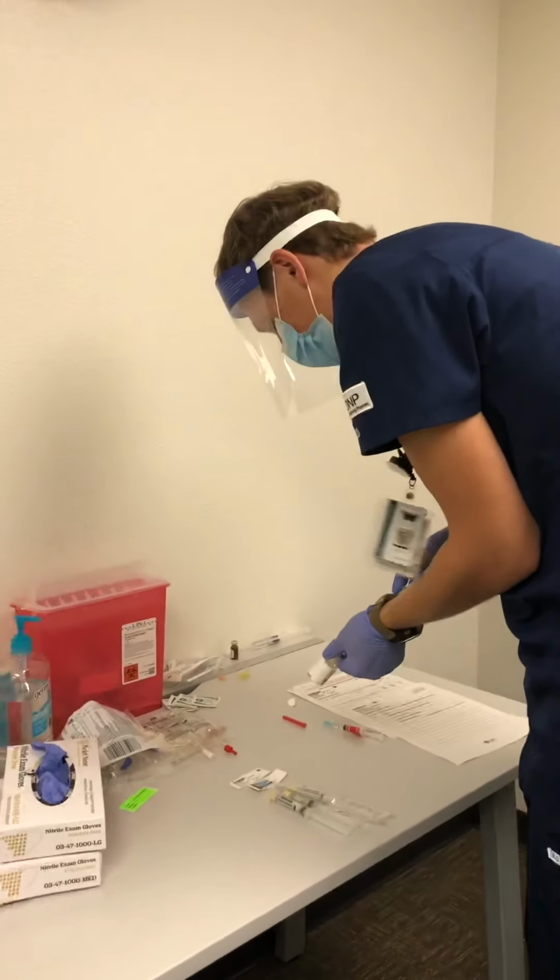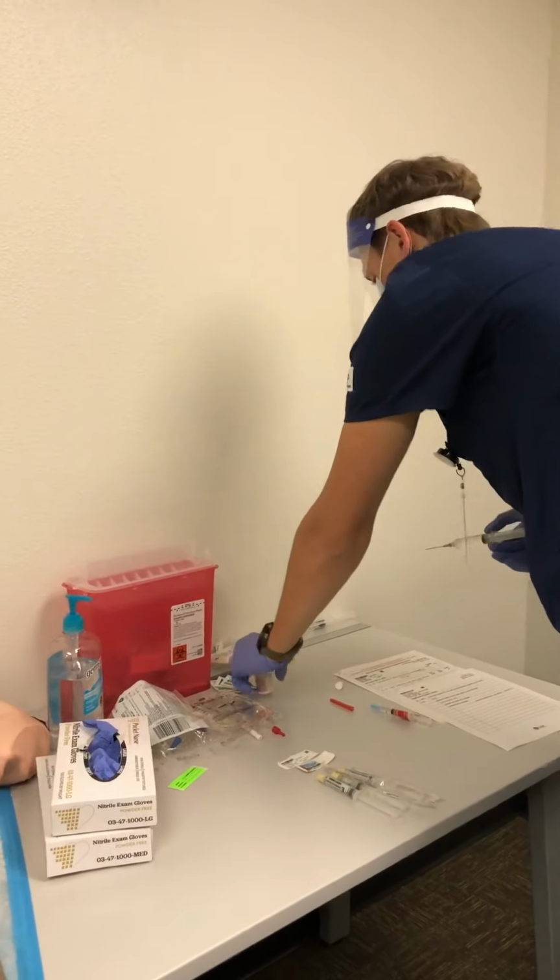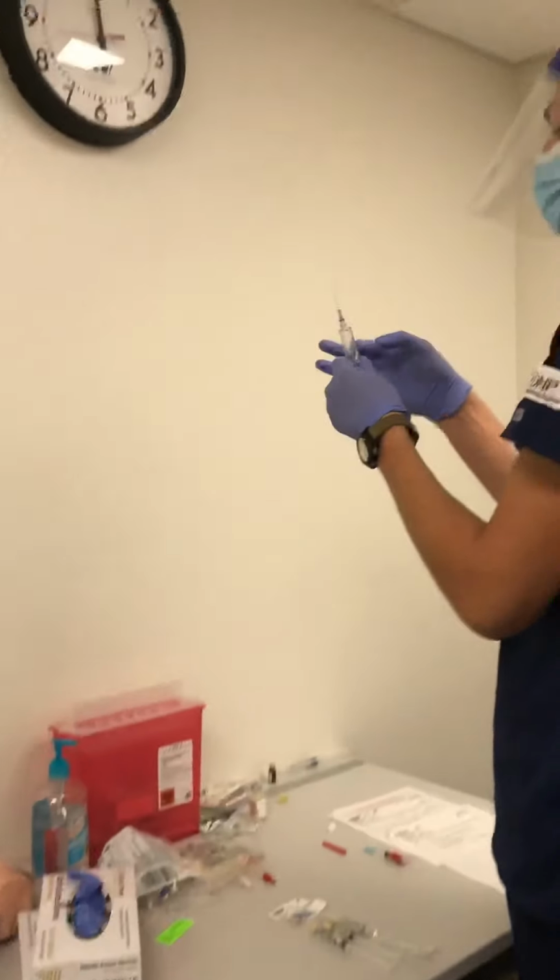Dispose of that, make sure I got all my air bubbles out.